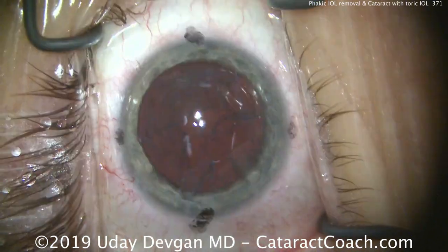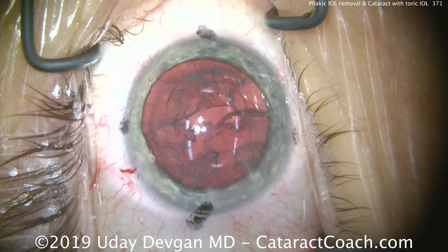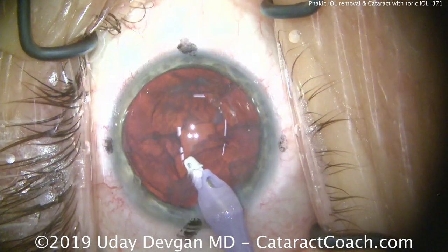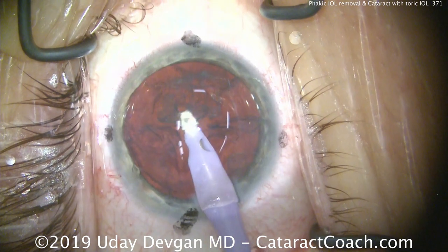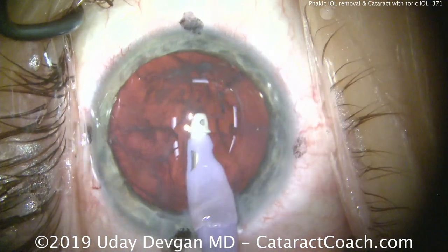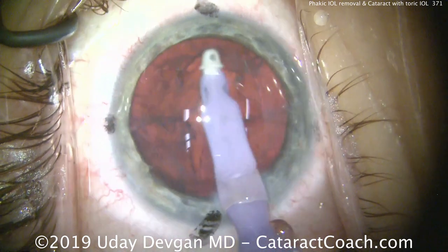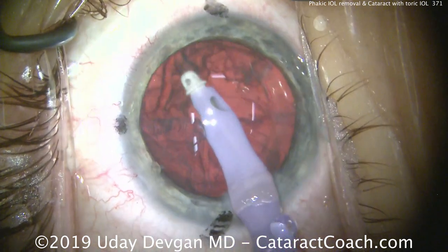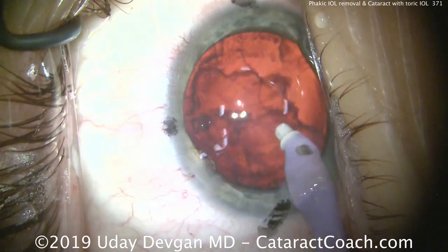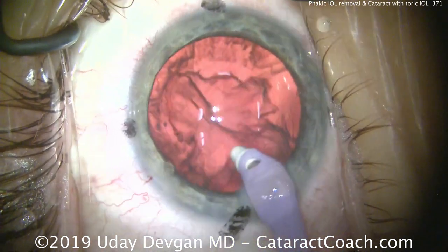The lens nucleus has been completely removed — that went beautifully. We'll adjust our light here to bring out the red reflex a little bit more. Now we're ready for the I/A probe to remove the cortex. Taking our time, we'll do a nice gentle job to remove all the lens cortex and clean up the capsular bag nicely. This patient has a large degree of myopia, which we'll certainly address, and about two diopters of corneal astigmatism, which we can effectively treat with a toric IOL.